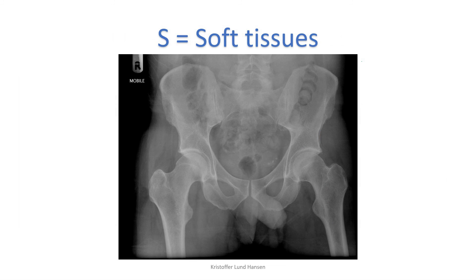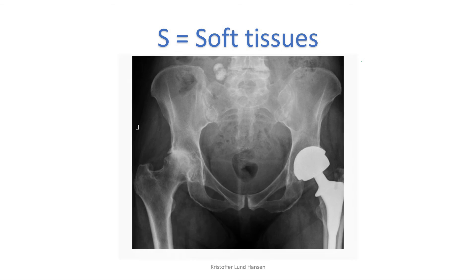The last point — S stands for soft tissue. The main things you will do here are to notice any swellings or effusions (remember effusion is just accumulation of fluid), and you should also notice foreign bodies or calcifications. Here we have a case of a foreign body which is a hip joint replacement.